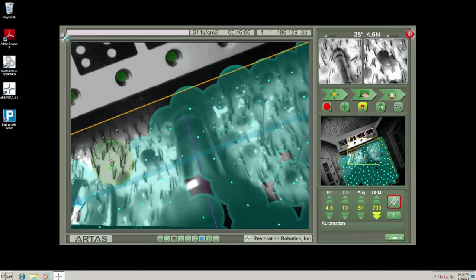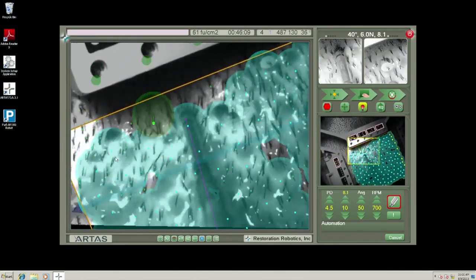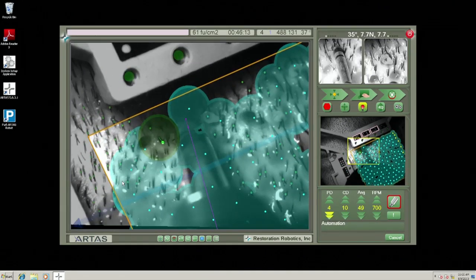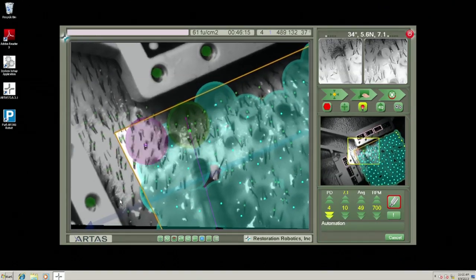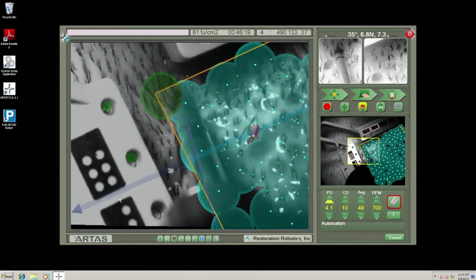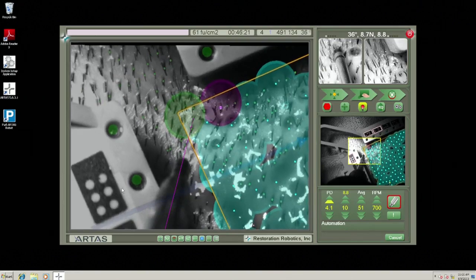So that, I think, speaks to your concern about, are we damaging these follicles by putting them under oxidative stress in an anaerobic environment? And there's no question that you are, but can you minimize that? And that's the benefit of using hypothermosol.